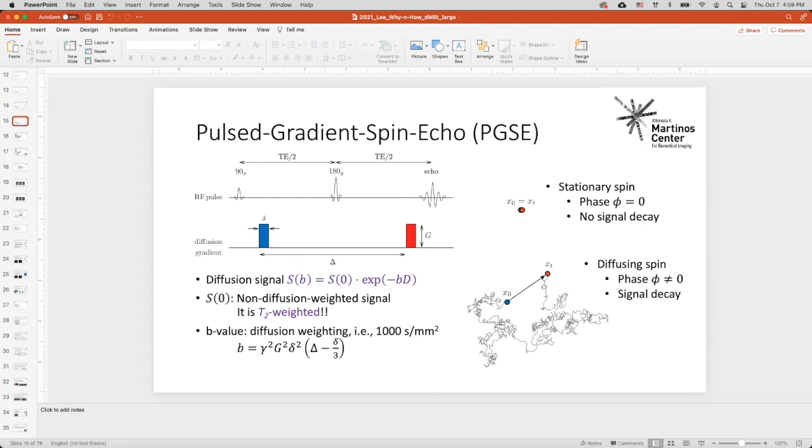Another way is to do super resolution. So 2 years ago, we used MP-RAGE, which has the high resolution details in T1 weighted image, and we have a low resolution DWI, which has the distortion all corrected. And then we can use a very simple self-similarity, which uses just a simple Gaussian kernel to do a smarter interpolation.